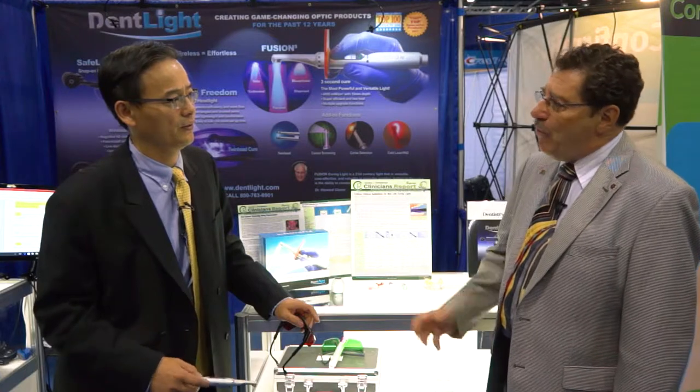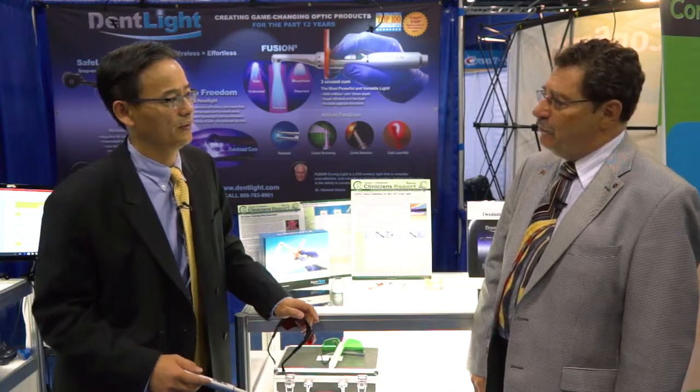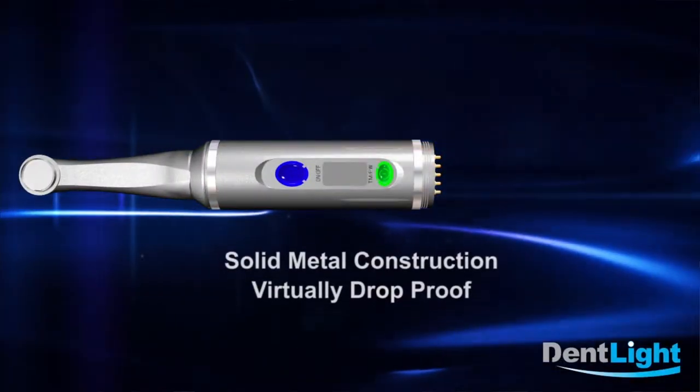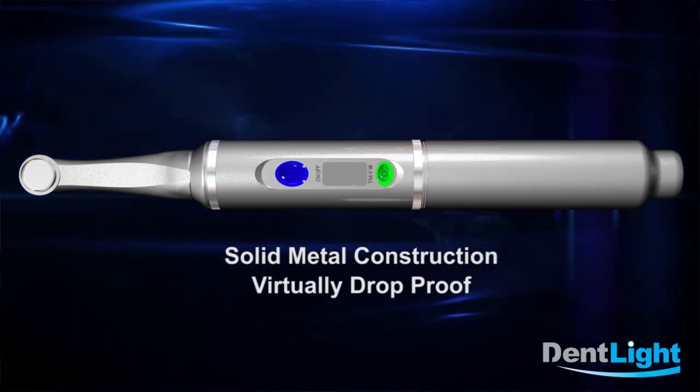Now in the dental practice we tend to unfortunately drop lights and otherwise do bad things to them. How solidly is the Fusion 5 constructed? This whole thing is made out of aircraft aluminum. We can actually drop it on concrete a hundred times at waist level without any problem — we actually turn it on so it drops live. And let's see, does it still work? Yeah.